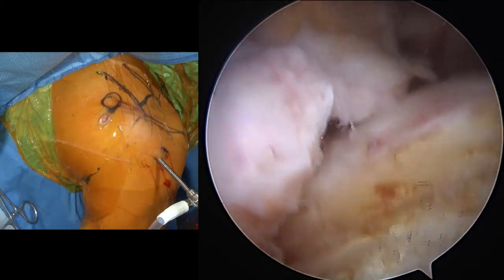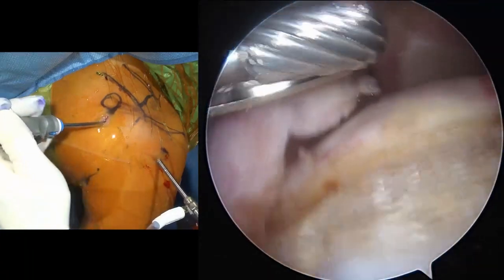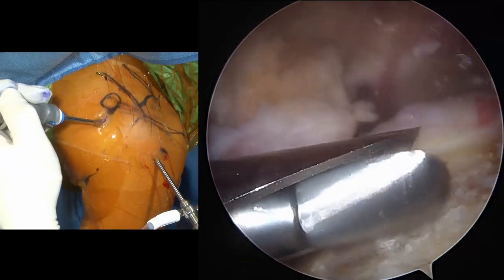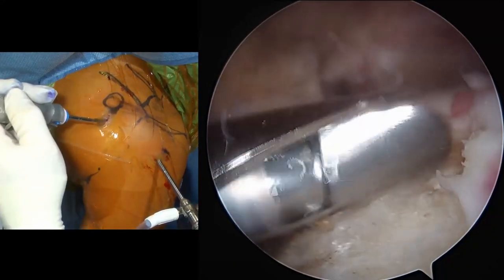Okay, burr. Go in reverse. Just going to prepare the tuberosity footprint here.